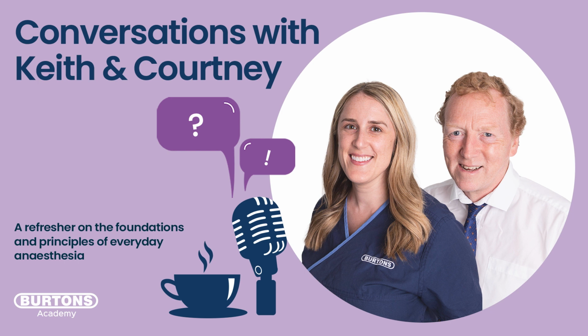And that may be more resistant to being forced down than the chest would be to being forced outwards. So we may see that we actually get a reduction in compliance and it's harder to push that diaphragm down, so our pressure goes up. What I'm kind of getting at is by squeezing the chest, we've actually reduced the compliance. In volume cycling, we're going to make it such that the pressure will be higher at the end of each inspiratory phase.